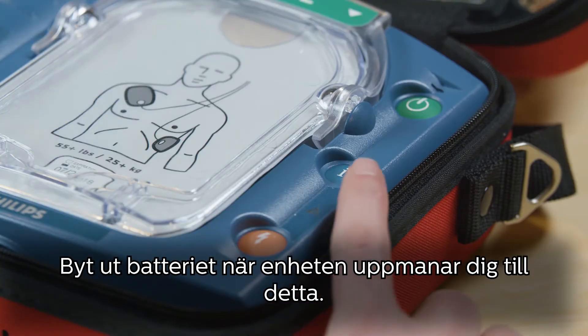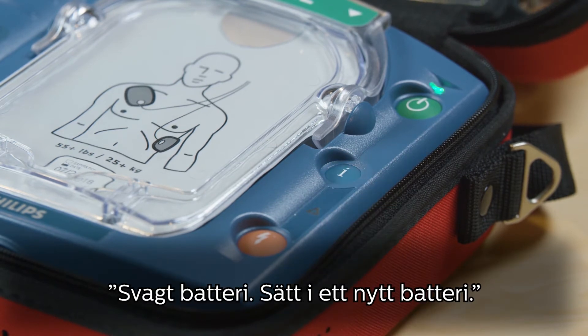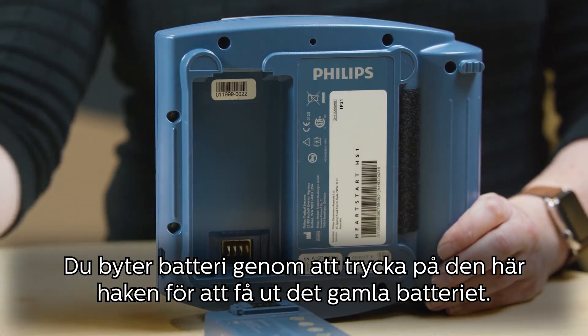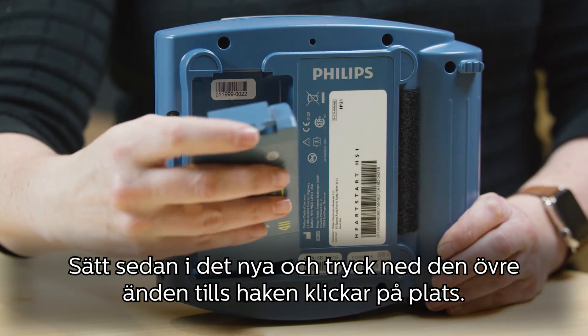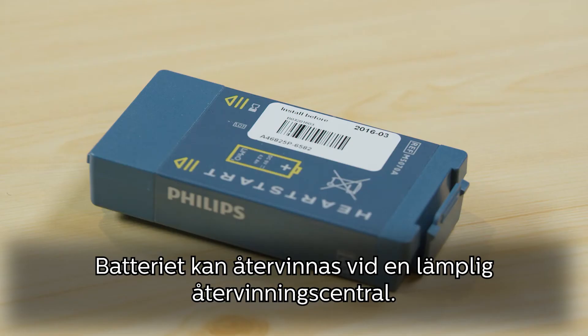Make sure you don't open the film seal of the cartridge until you need to use the pad. Replace your battery when your device alerts you with a low battery warning. To change the battery, press this latch to pop out the old battery and slip in the new battery, pressing the top end down until the latch clicks into place. The battery can be recycled at an appropriate recycling facility.